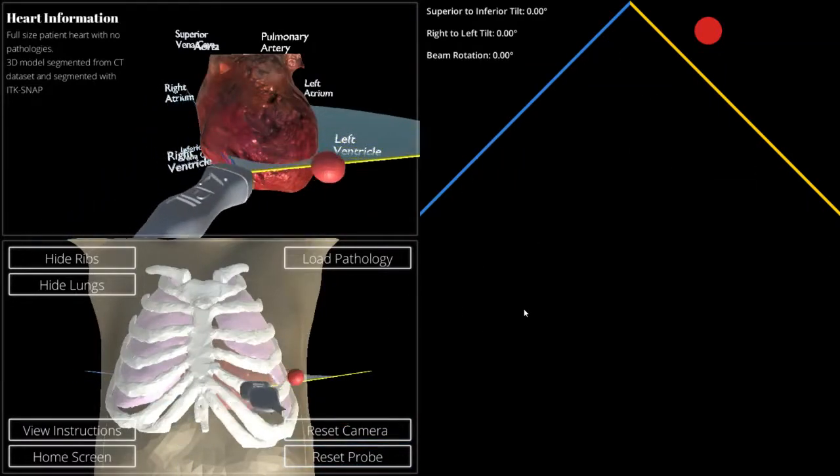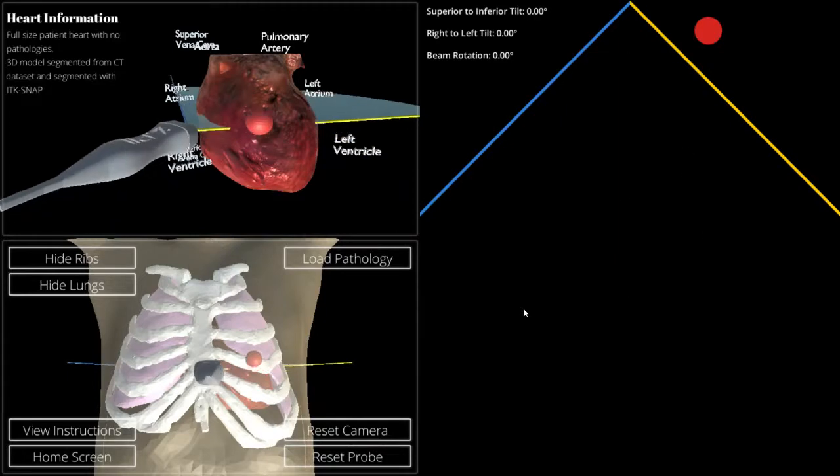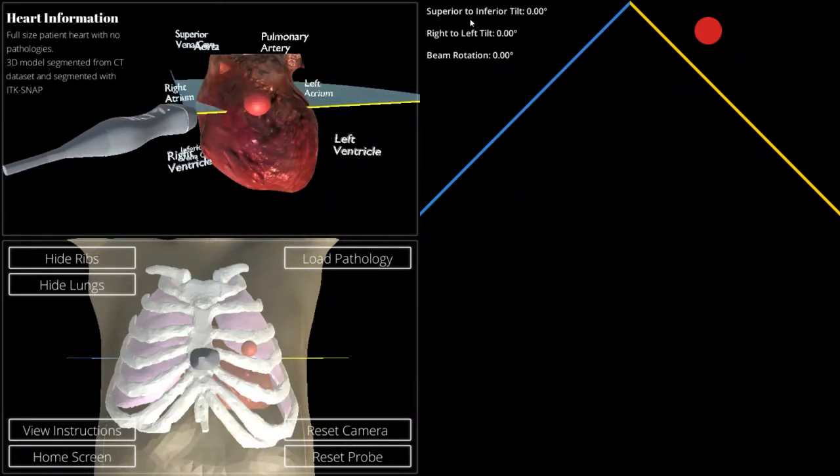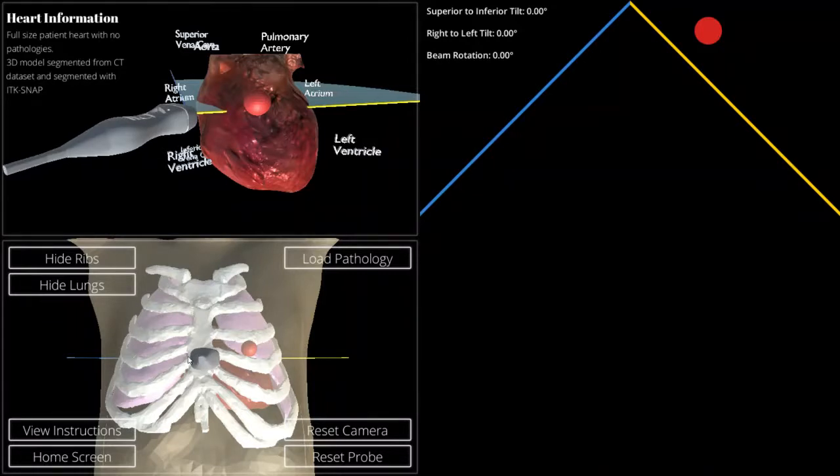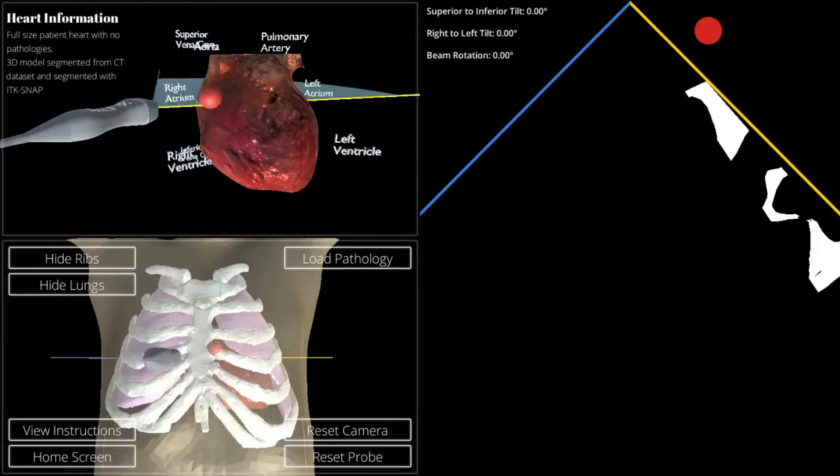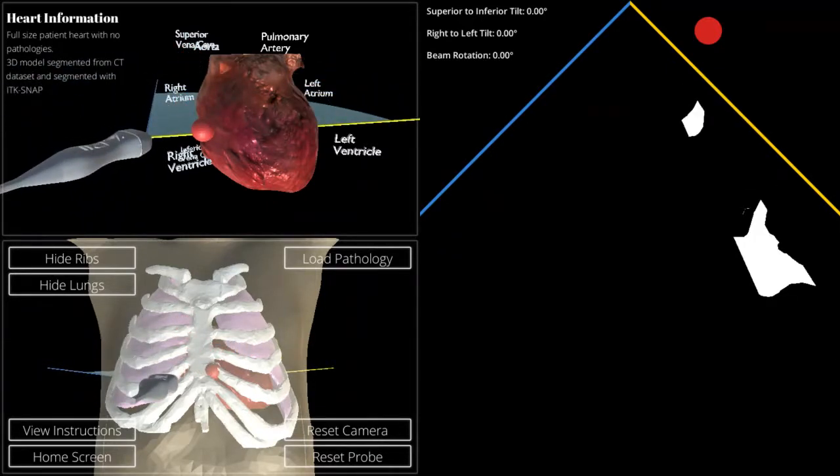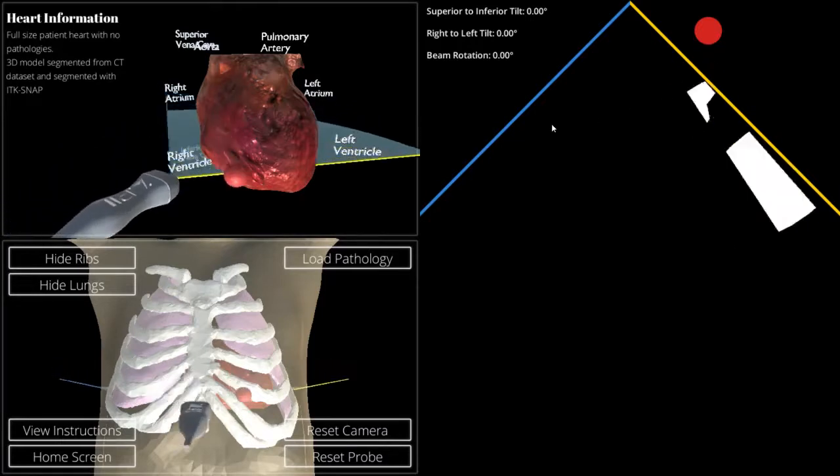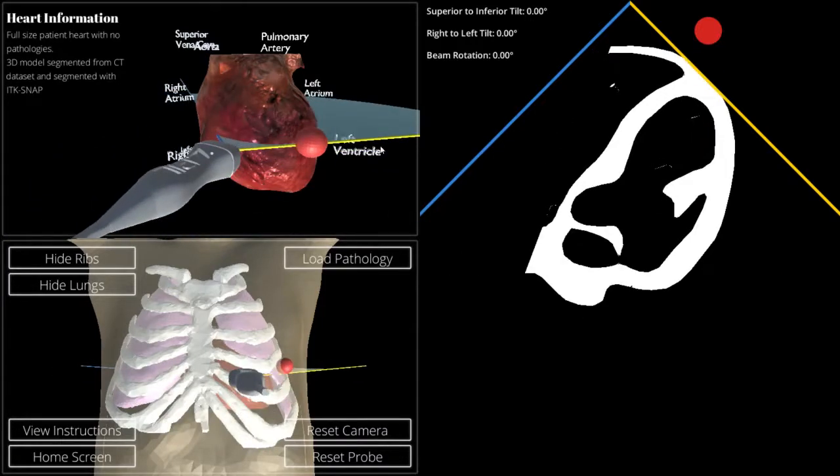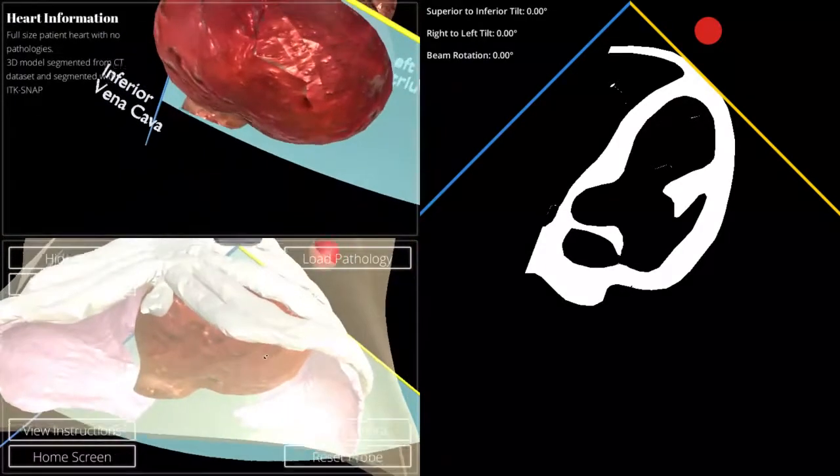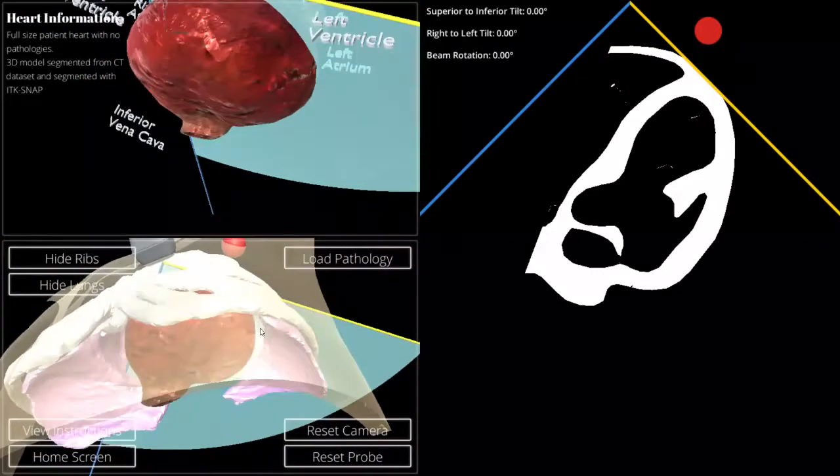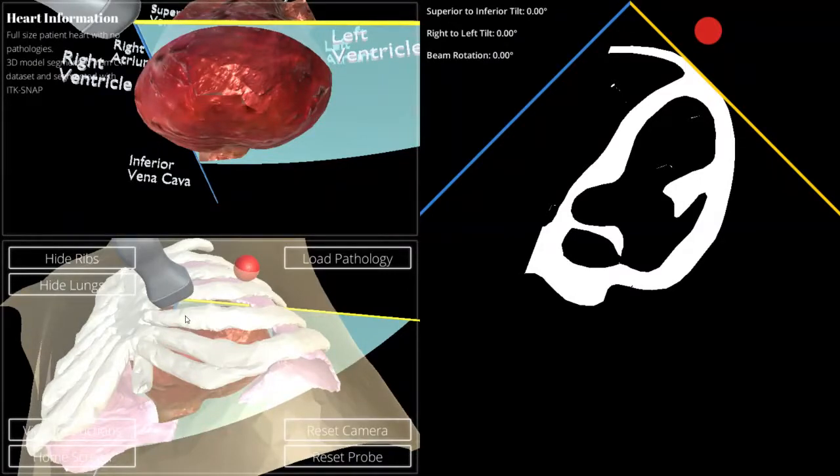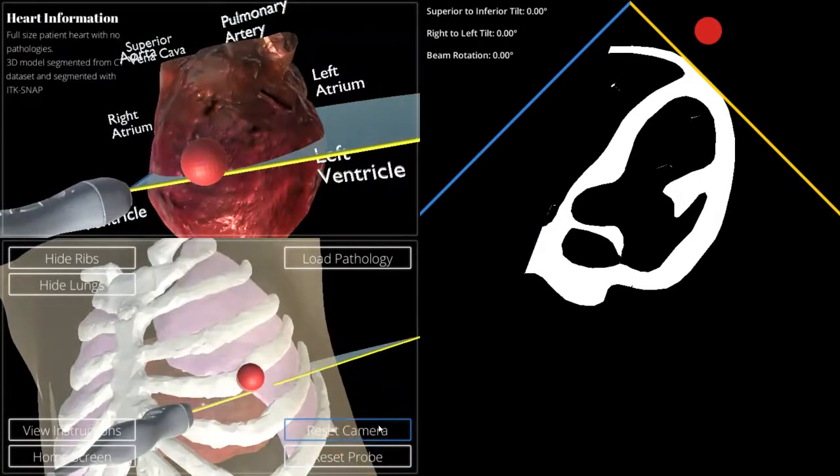Now we can start to get into some of the features here. As we pass over the ribs, there is nothing on our ultrasound window on the right-hand side of the screen. Our readings are at 0 degrees inferior to superior tilt, right to left tilt, and beam rotation. As we begin to move, however, we can see that there are flashes of images on this screen. Those flashes basically indicate that the ultrasound beam is passing through some portion of the person's chest. This is happening because this ultrasound beam is being dynamically generated at runtime and being occluded by the ribs and the lungs, as you would expect in a real ultrasound examination.